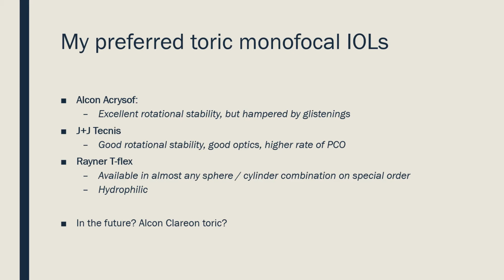For extreme cases, Rayner offer a fantastic custom-made service whereby pretty much any power of toric IOL can be ordered. The downside is that they are hydrophilic, and as we've seen, that leads to less rotational stability and also an increased risk of opacification.